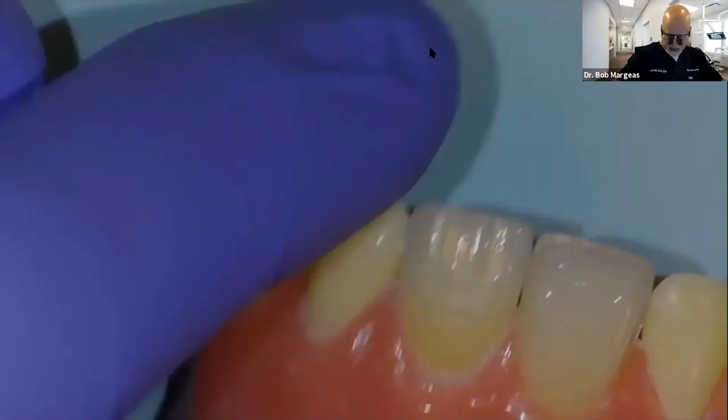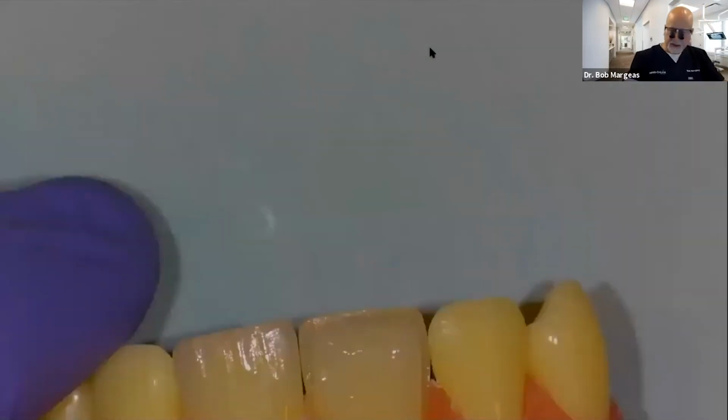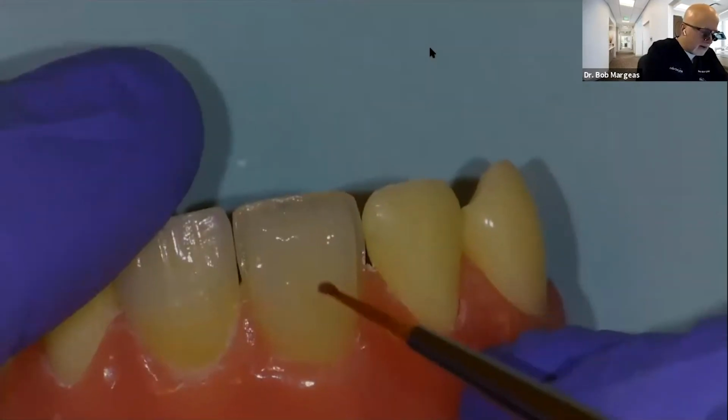So what I'm going to do is take now a little bit of violet, of the Creative Color violet. And I'm going to place that, I'll show you here in a second, into the incisal edge and the interproximal. As I said, these tints are hot. So you see how much I have on here?